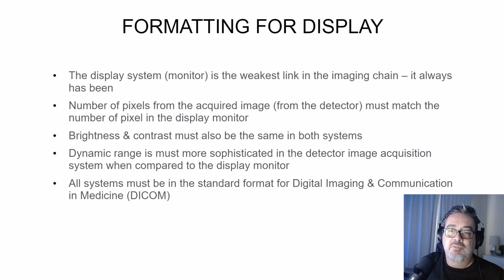This is also why it's not recommended to manipulate your image to look good at your technologist workstation. You might be working with a $100 monitor with a very limited number of pixels for display and trying to make improvements while the radiologist is sitting back there with a $20,000 monitor with extremely high resolution and more than capable of matching or even exceeding the pixel count when compared to the detector.